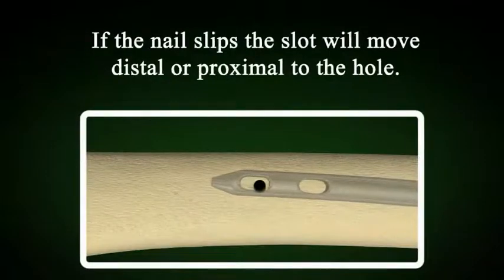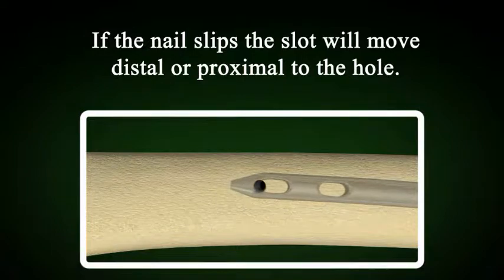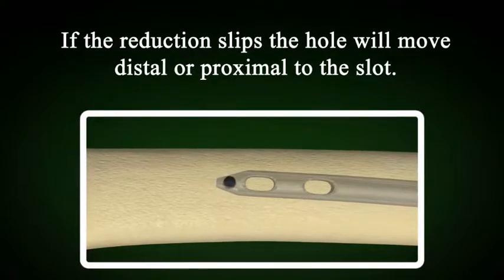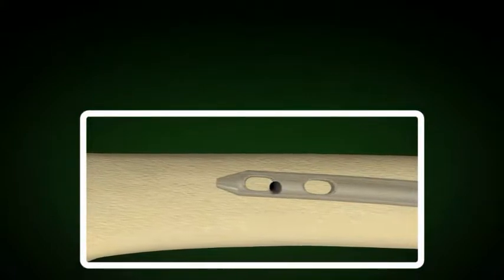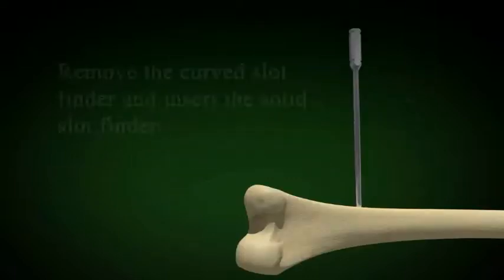The longitudinal slip is due to one of two things. Either the nail has slipped and gone farther into the bone or more prominent, or the reduction has been lost and the bone has slipped. The hole will not align with the slot of the nail unless the longitudinal malalignment is corrected. If the curved slot finder does not find the slot, either the nail has slipped or the reduction has slipped.